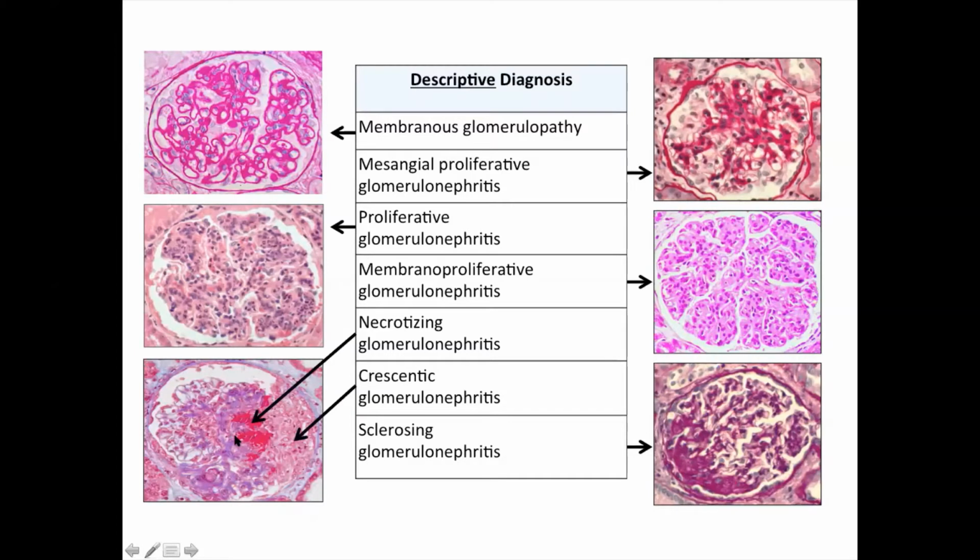لما يكون عندنا necrotizing glomerulonephritis. لما يكون عندنا fibrinoid necrosis, this is necrotizing glomerulonephritis, and when we have crescents in more than 50% of the glomeruli, this is crescentic glomerulonephritis. وإذا كان عندنا scarring طبعا أو يعني segmental scarring, this is sclerosing glomerulonephritis. أما هو focal segmental glomerulosclerosis أو global glomerular sclerosis لما it is involving the entire glomerulus. Okay.